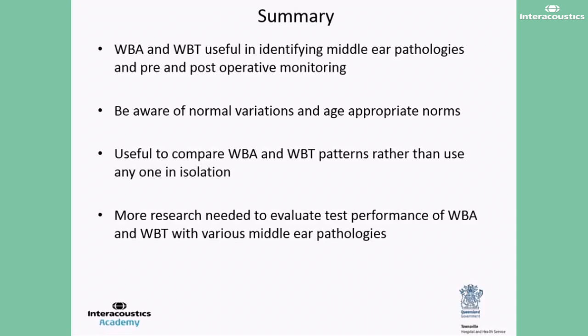Pressurized absorbance is an additional tool that can be used to improve diagnostic accuracy. Comparison of ambient and pressurized absorbance has been found to be very useful in differentiating ears with and without effusion. Nevertheless, importance of wideband tympanometry in identifying disorders in other middle ear disorders is not examined as extensively. So we'll be seeing more of research coming in this direction to assist in the identification of other middle ear disorders.